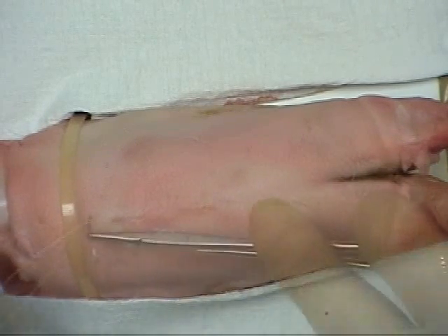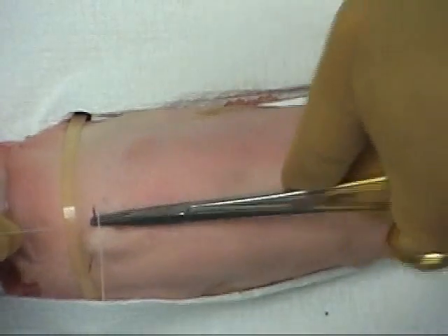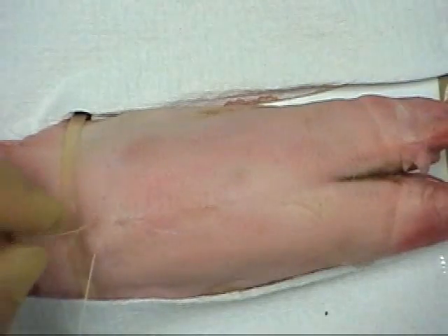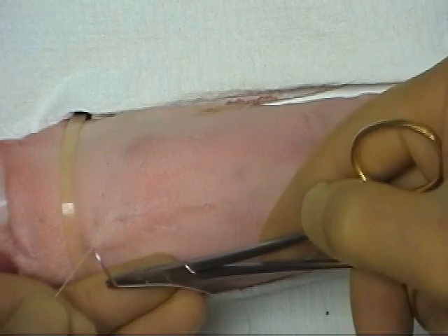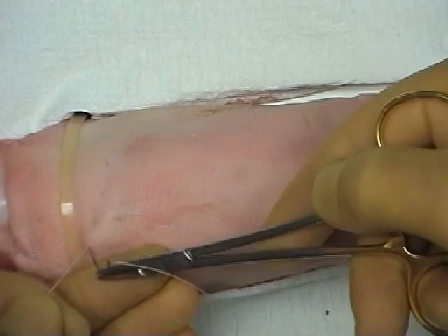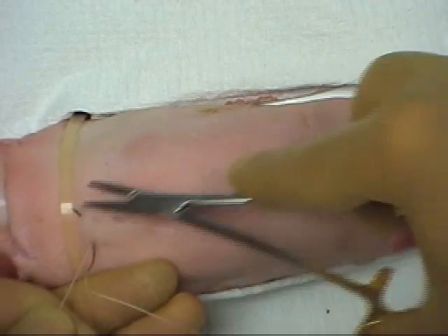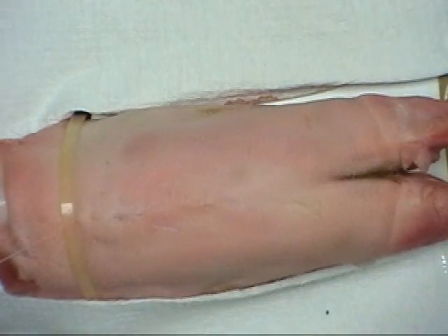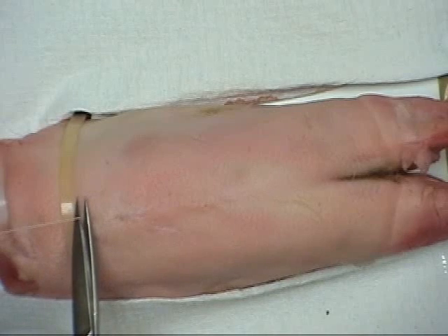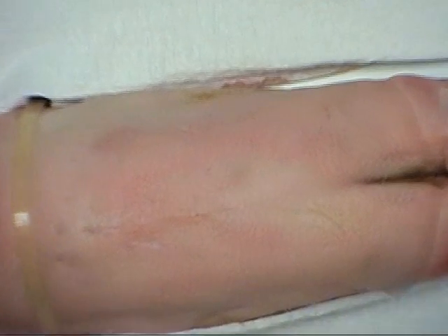A Z-shaped suture is placed, passing the needle back into the skin close to the previous exit point and driving it perpendicular to the incision. To complete the Z-suture, the needle is again inserted at the previous exit point and driven perpendicular to the wound. The suture is then divided flush with the skin surface, leaving the wound closed with no visible suture.